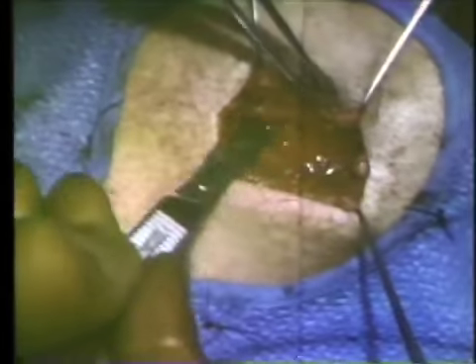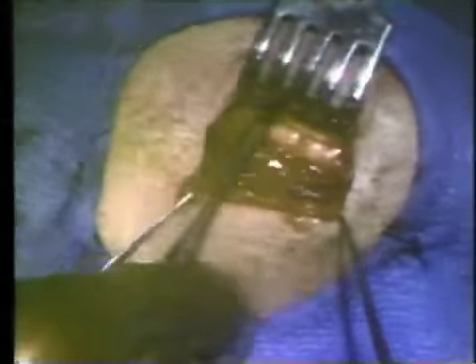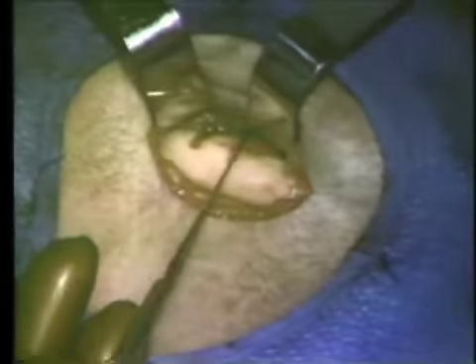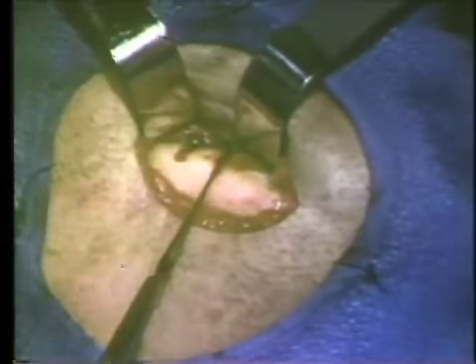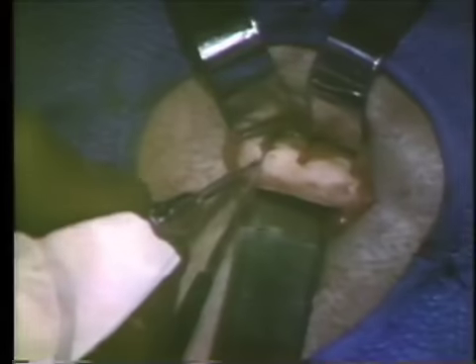The dissection is being carried out here in layers through the skin, superficial fascia, platysma muscle, and now down through periosteum as the periosteum is reflected to the target, and the target, of course, are those two cuts that were a part of the first stage procedure. Here they are identified, and using the guides again, the cuts will be completed to the inferior border.